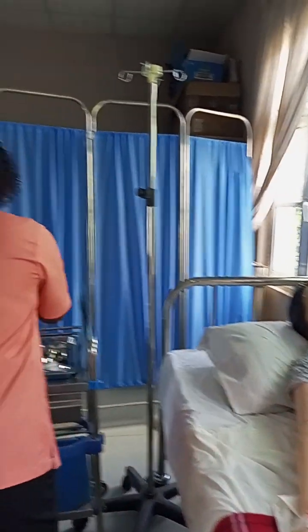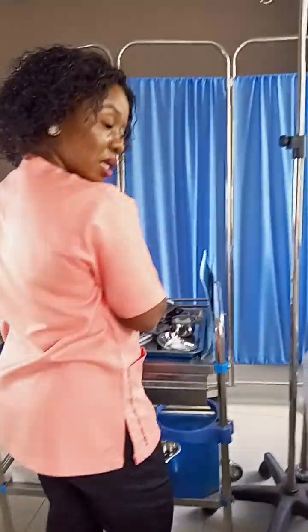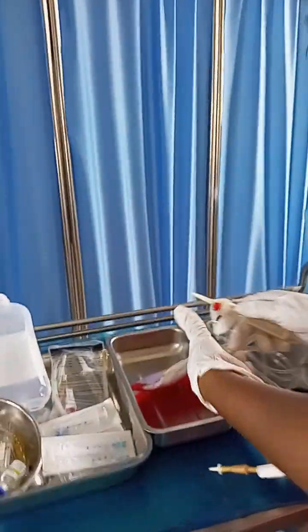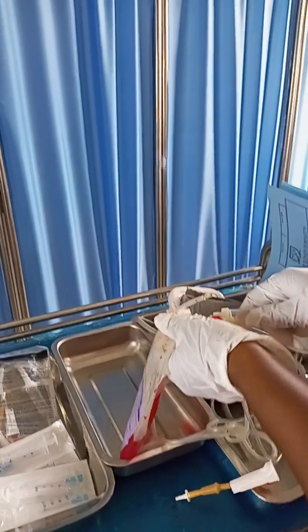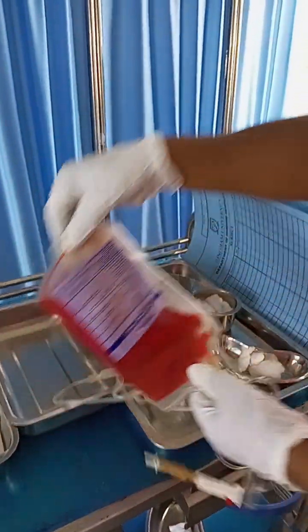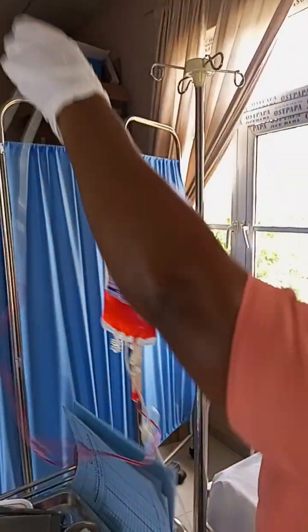So now the next thing is for me to connect the blood giving set to the blood bag. I'm using this as the blood. So I will hang it.